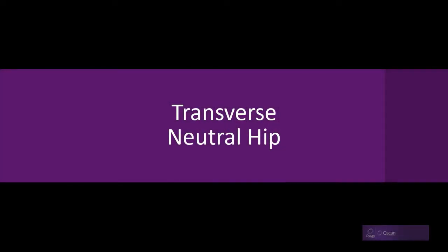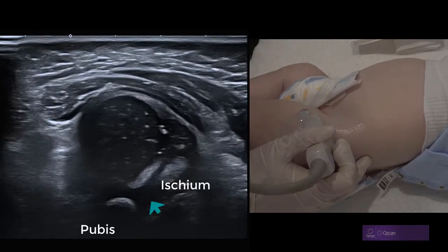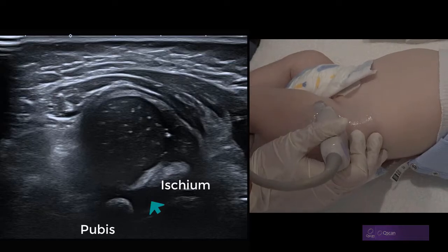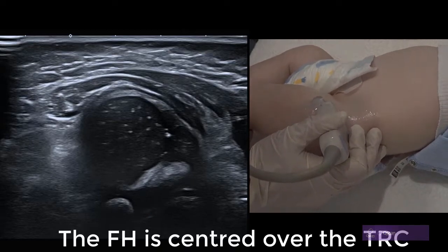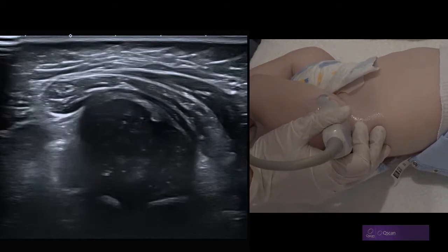We can assess DDH in a transverse plane as well as coronal. The first image is usually a neutral image with the hip out straight, looking for the triradiate cartilage — indicated by the green arrow — and ensuring that the femoral head looks centred over that cartilage. You have the ischium to the right and the pubis to the left, which is anterior.